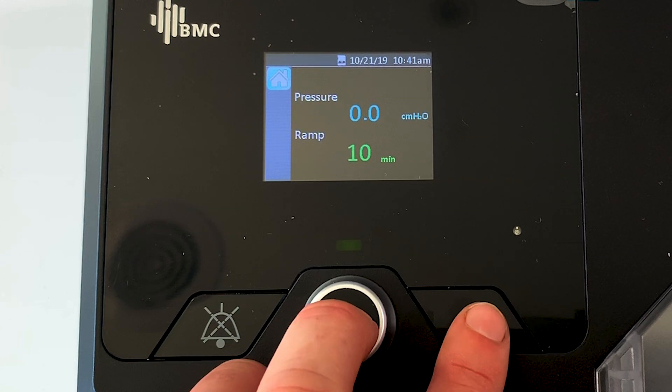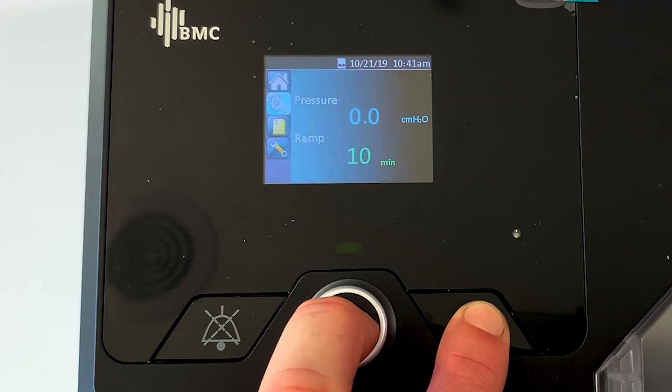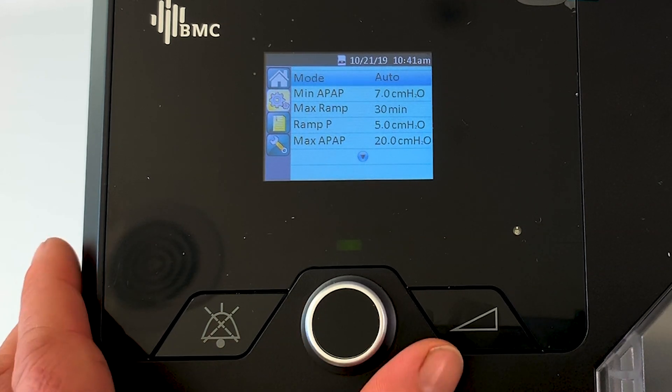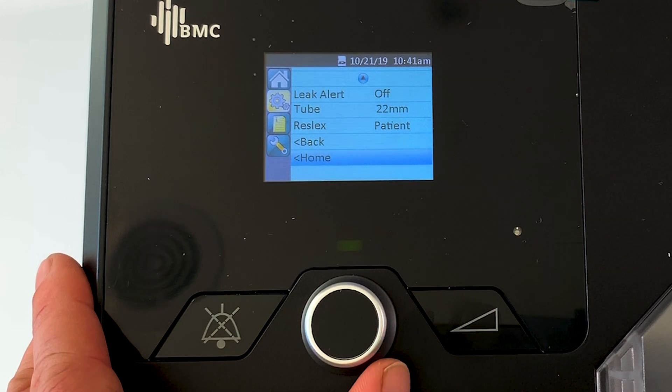In order to get into clinical settings, there's a little trick: we need to hold down the main knob and the ramp button simultaneously for about five seconds, and then boom, we're into the clinical settings. We just need to press the main knob one more time.